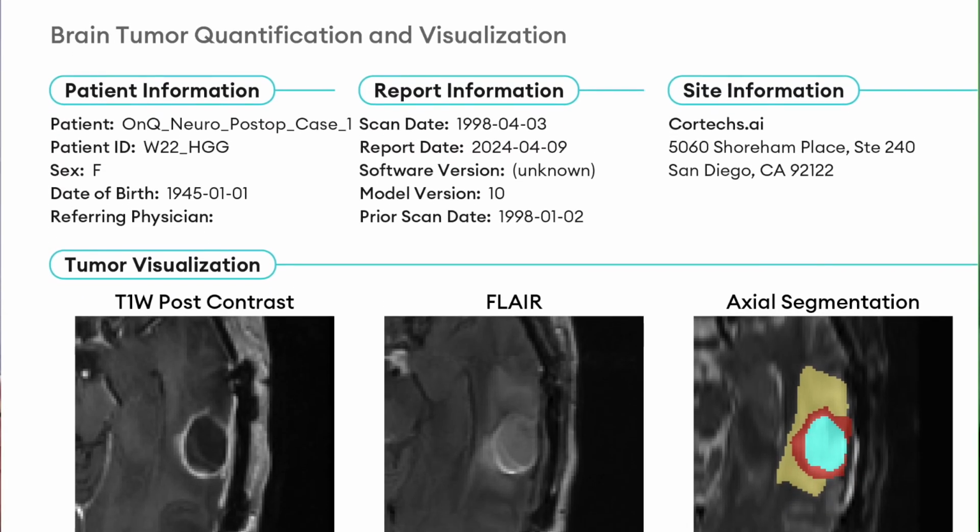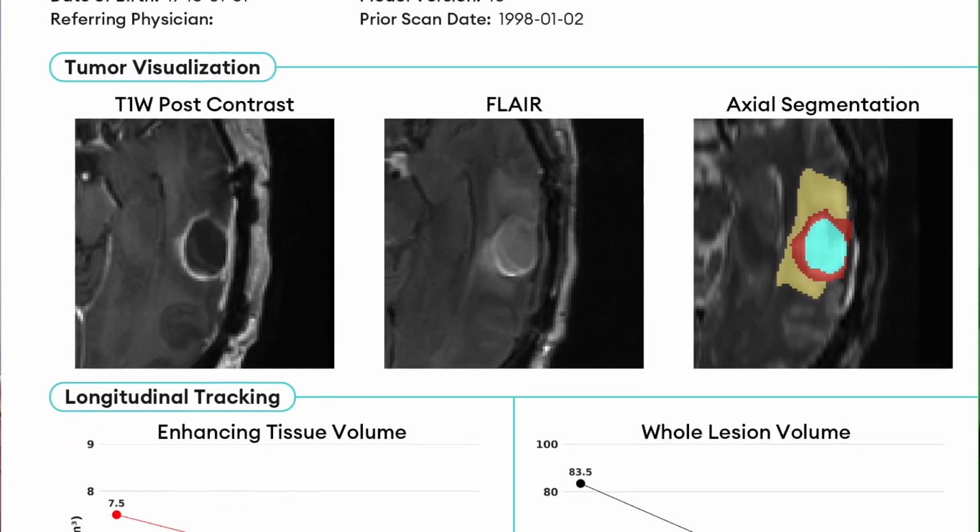And again, in the near future, moving out of just gliomas and into other kinds of brain tumors, meningiomas, and metastases, it can make the difference. It really can make the difference in a patient's life. You want to identify the lesions, as in metastases, they start at like 1 millimeter in size. To be able to use automated software to detect the metastases, if you start treatment earlier, you can absolutely impact morbidity and mortality. So again, I see this kind of tool as becoming standard of care in the future.